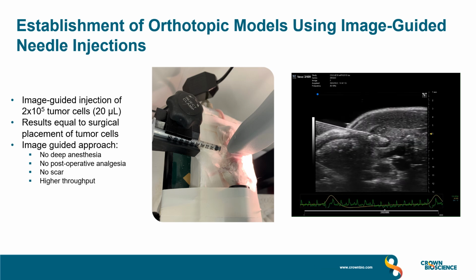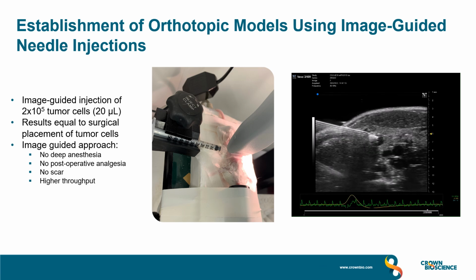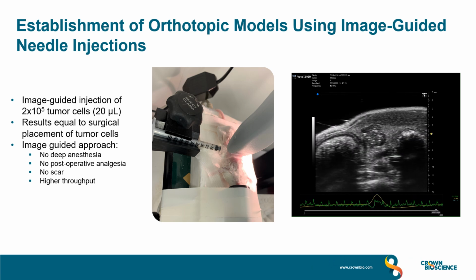The advantage here is that it does not require deep anaesthetic. There's no post-operative analgesia required. There's no scar, and it's higher throughput. And it's much, much better for the animals. Within about 10 to 15 minutes, the animals are up and running around their cage again, as opposed to traditional surgical approaches, where you can take up to an hour for animals to recover from the procedure.